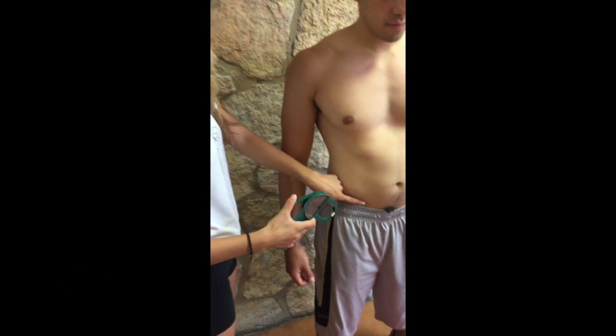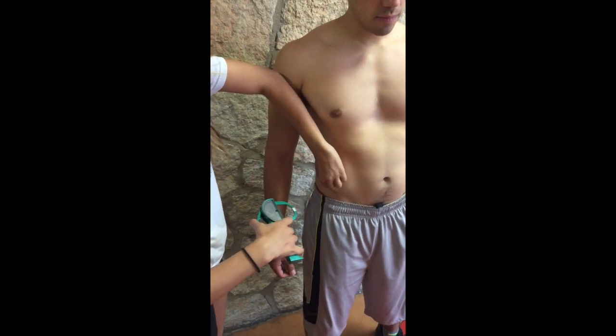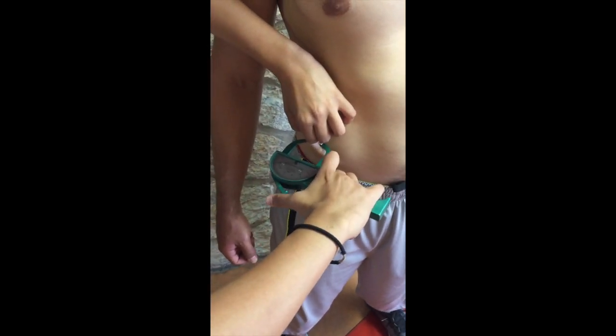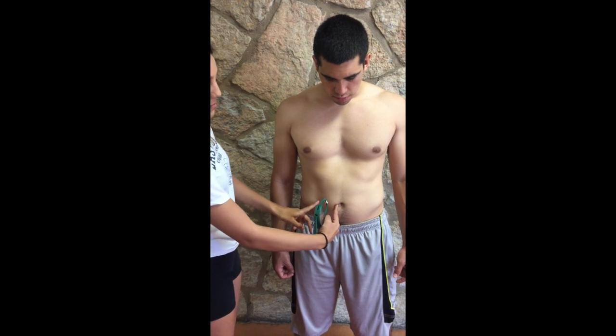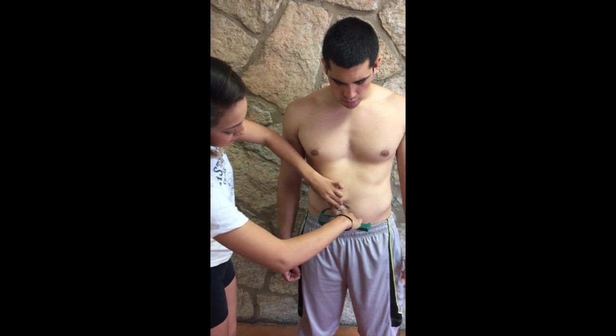The suprailiac is measured using a diagonal fold in line with the natural angle of the iliac crest. The abdominal fold is taken about 2 centimeters to the right of the umbilicus in a vertical fold.